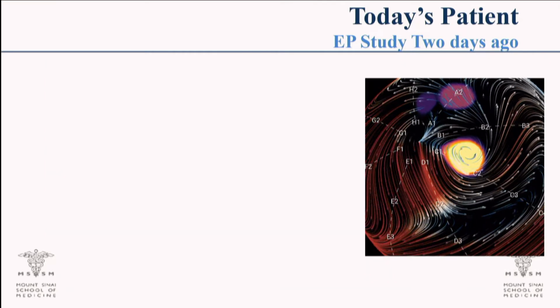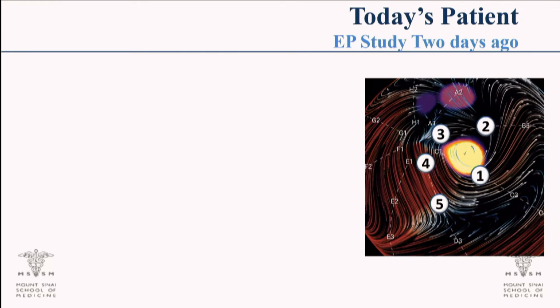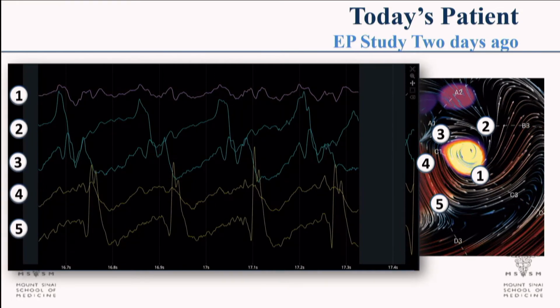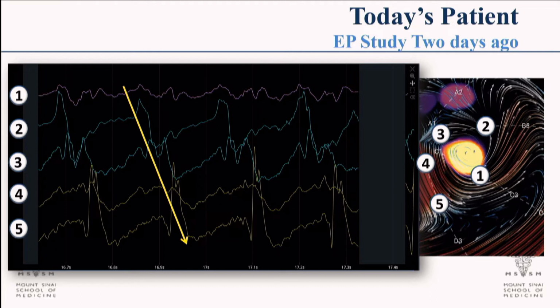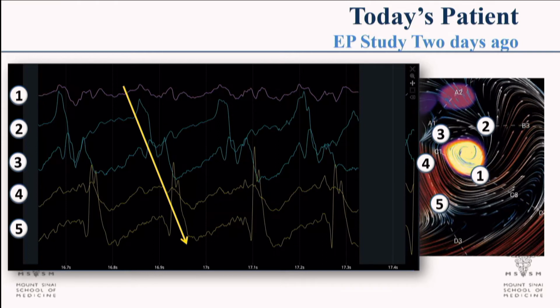Now look at this. If we look at the individual electrodes, 1, 2, 3, 4, 5, we have a source going around a circle there. And then we actually look at the electrograms, the 1, 2, 3, 4, and 5. You can actually see the unipolar electrograms to help you confirm that this does seem to be real.